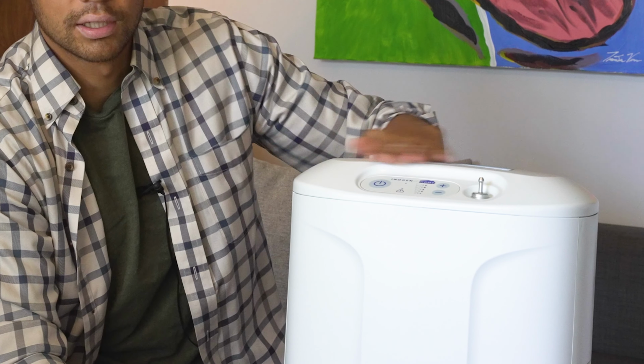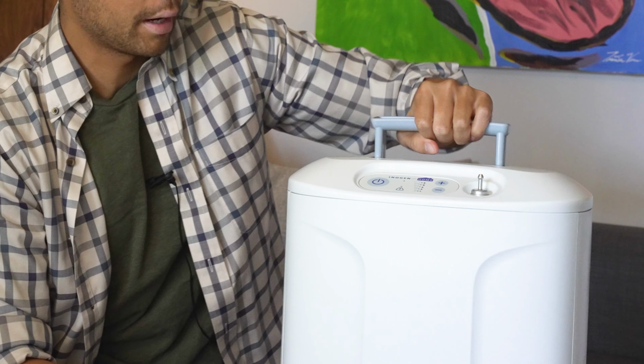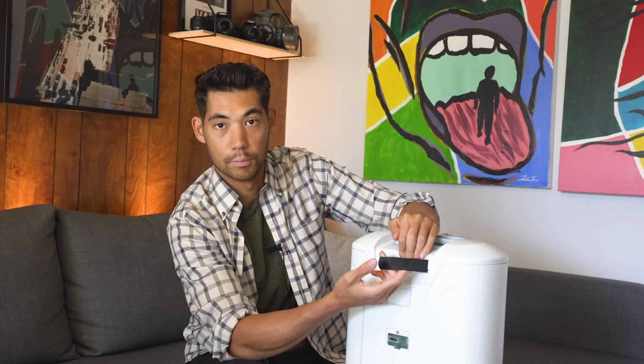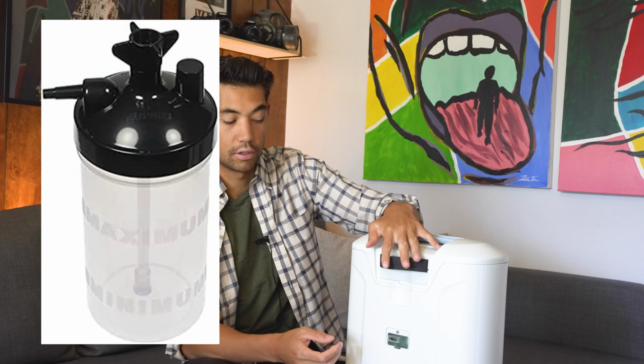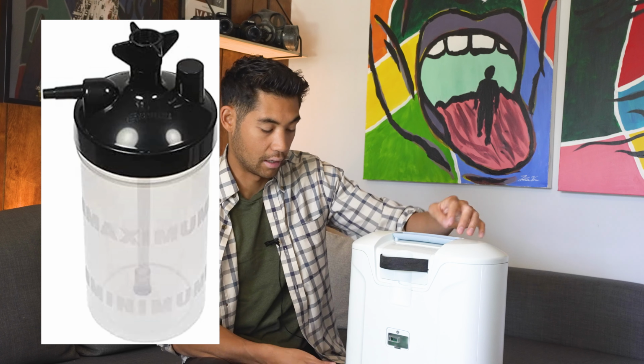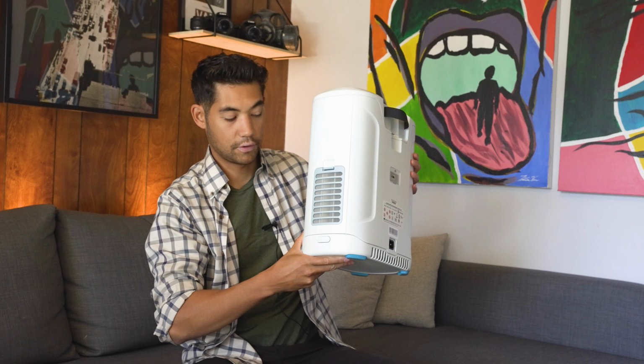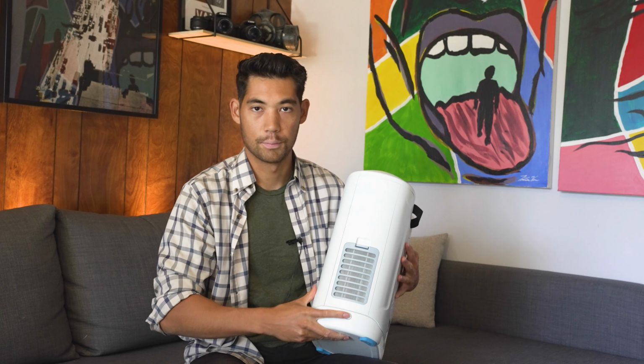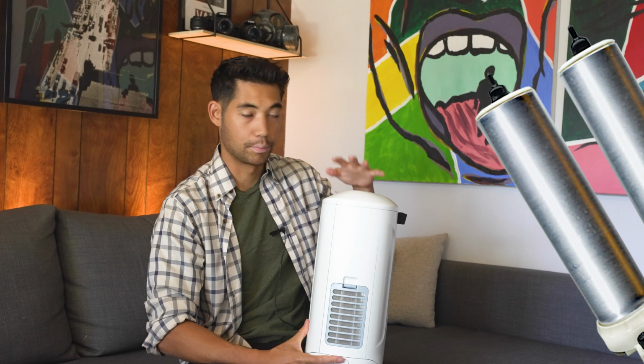Okay, around the rest of the machine, we have just a carrying handle there. I like how it just goes nice and sleek with the top. You can carry it around. On the back here, we have a filter and this band where you can put your humidifier if you want to connect your cannula to a humidifier. And then on the side here, we have another filter. And then on the bottom, we have some little rubber feet there. We have this button. This button will just help take the bottom portion off so you can replace the columns.